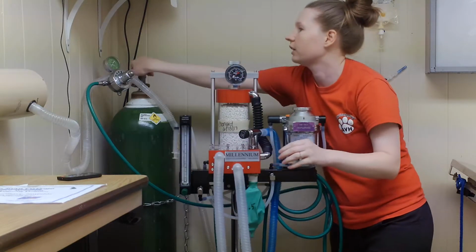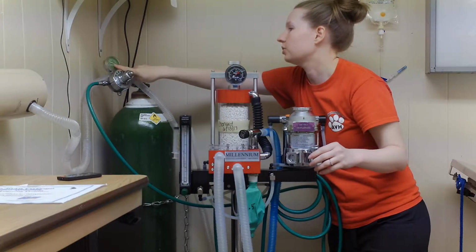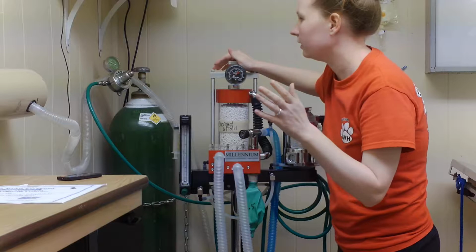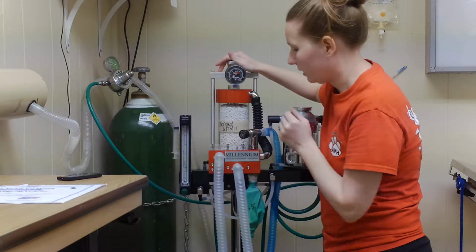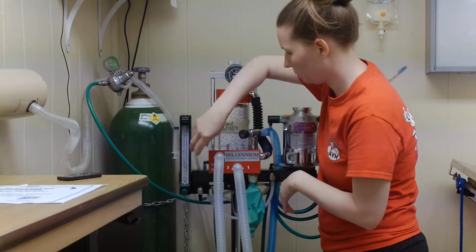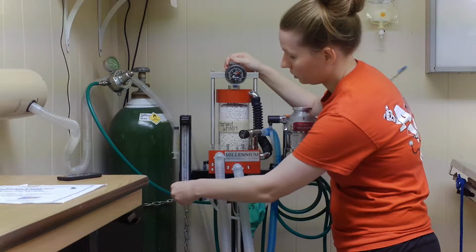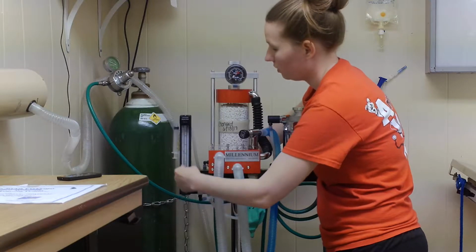I'm actually going to turn on the oxygen, and you can see that the oxygen tank has about half a tank, which is about 8,000 kPa, or about 1,100 psi pressure for oxygen in there. So anyway, it comes through, and I don't know if you can see the little ball come up, but that means that the oxygen is flowing just fine. So it comes through the back, through the flow meter.